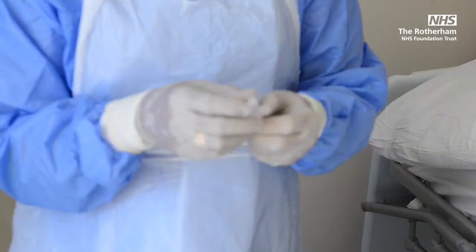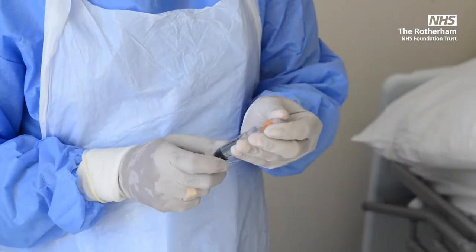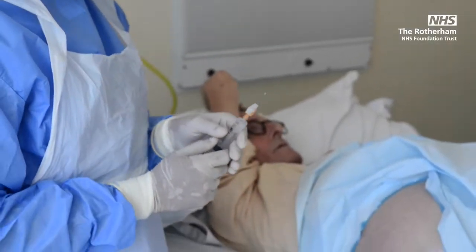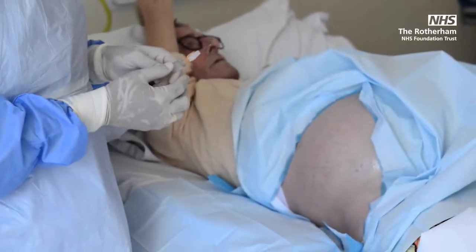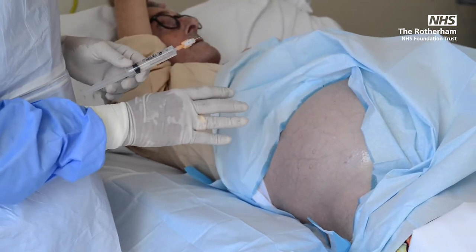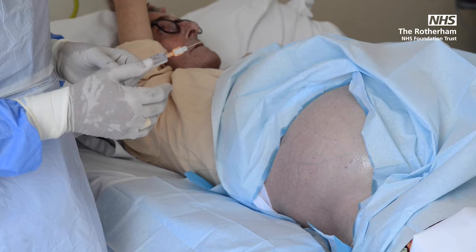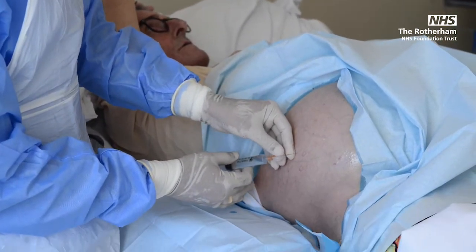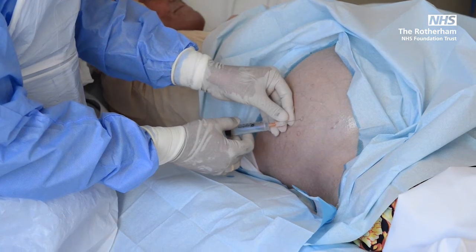So next we are going to use the orange needle, and I'm going to anesthetize the skin. Make sure that you go with an angle of around 15 to 30 degrees to the skin. Avoid any blood vessels on the surface of the skin, and try to make a bleb. Sharp scratch.